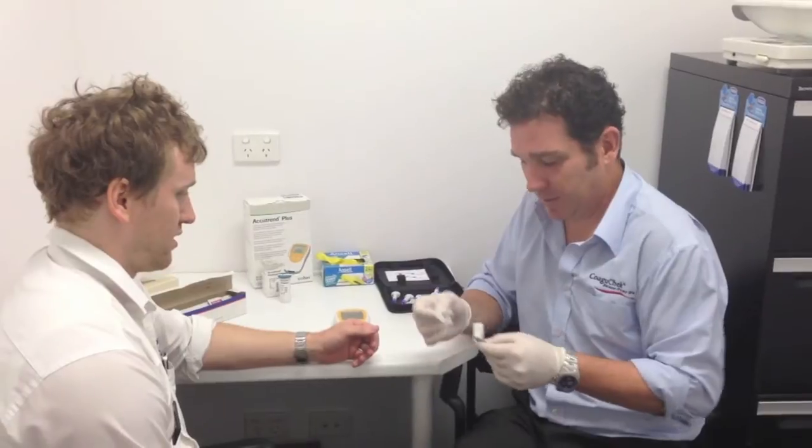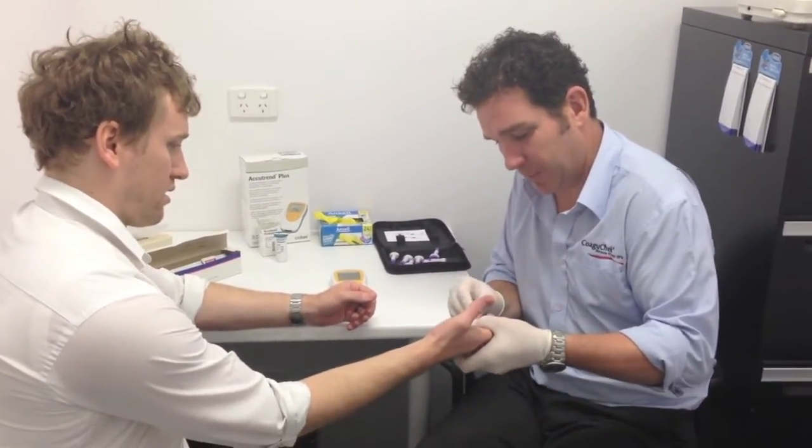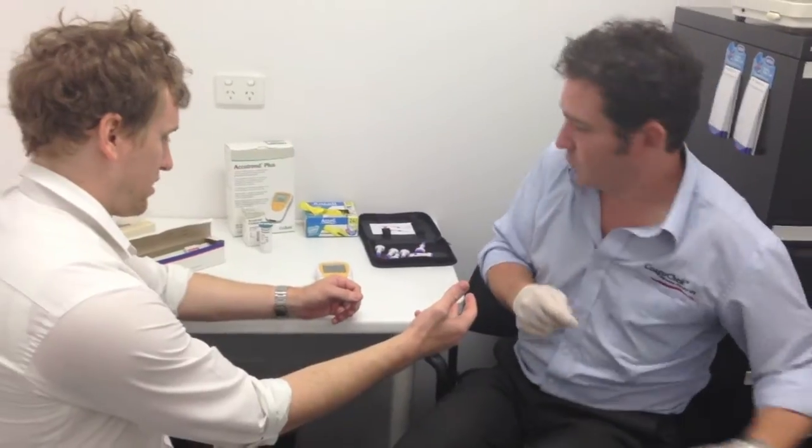So we just take the alcohol wipe and wipe that side of your finger, and just let that dry for a second.